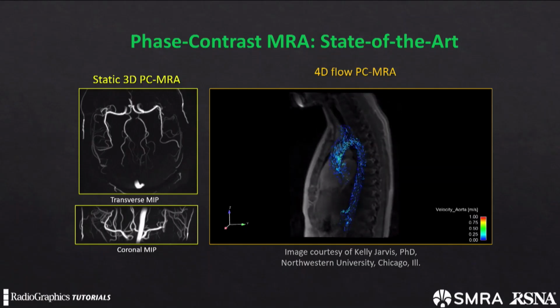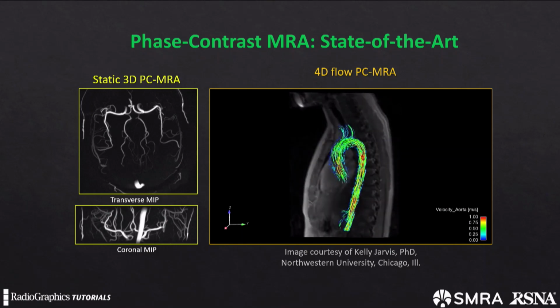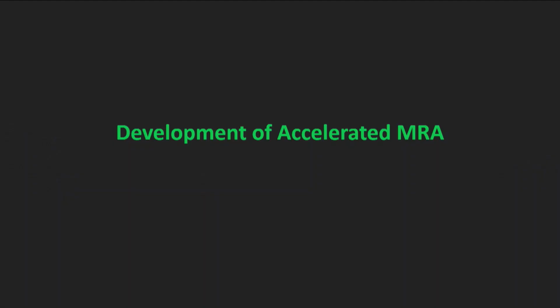There we go. So, the work by Michael Markl's group at Northwestern and others have taken 4D flow to a hugely useful clinical tool and also a great investigative tool that I'm sure many of you are actively involved in. So from relatively primitive early work to actually transformative, clinically useful work over a period of about 3 decades.